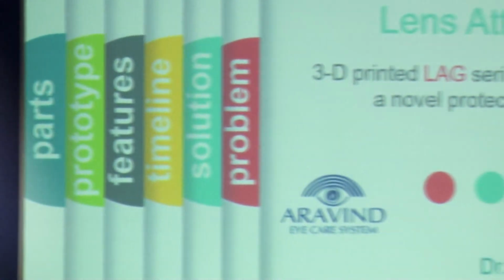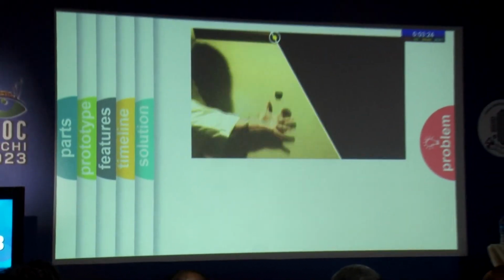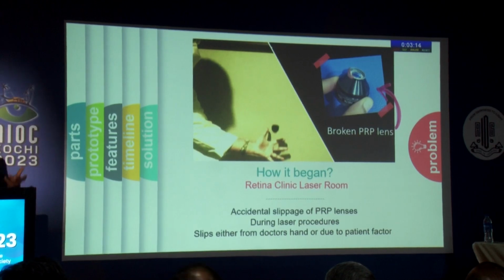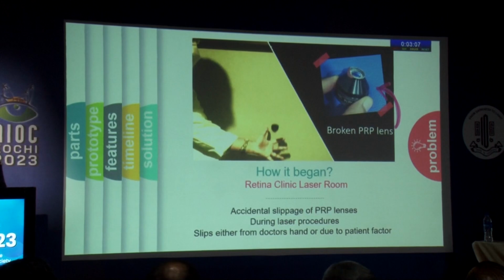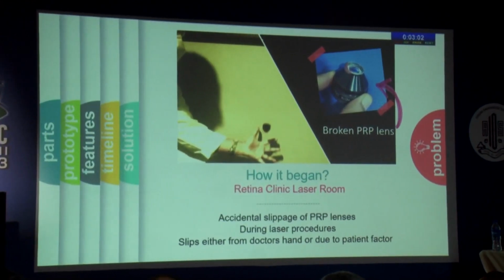So I will talk to you about LAG, Lens Attachment Guard. It is a 3D printed LAG series, a novel protection system for ophthalmological lenses. So how did this idea come to me? In our retina laser clinic, the PRP lenses, which cost an immense amount, break if they fall and come in contact with the ground. It can either slip from the surgeon's hand, or some of the patients are really uncooperative. You have to laser. If you don't have a multi-spot, your single spot will take time, and patients will get restless, and the lens can fall. It has happened to multiple fellows in our center.